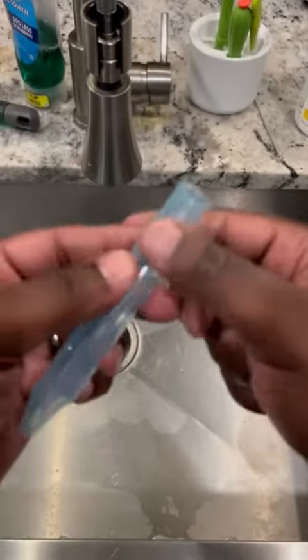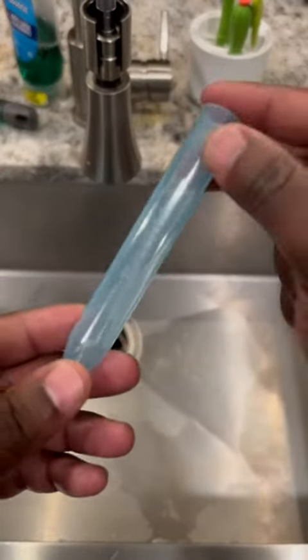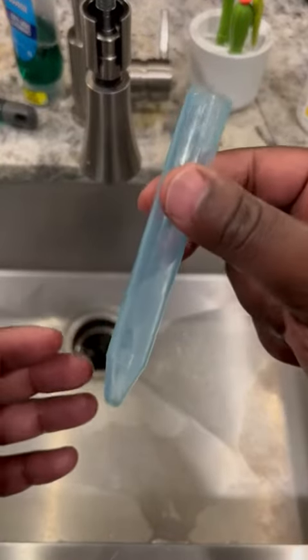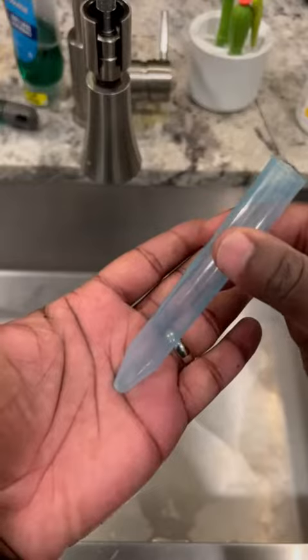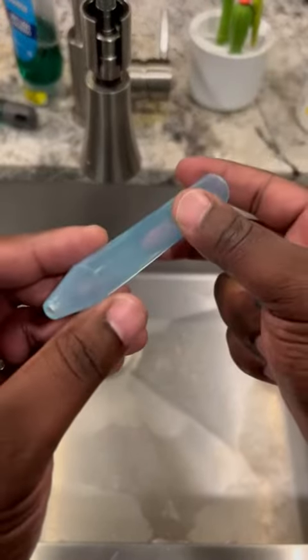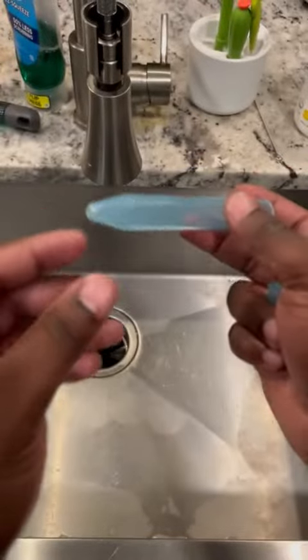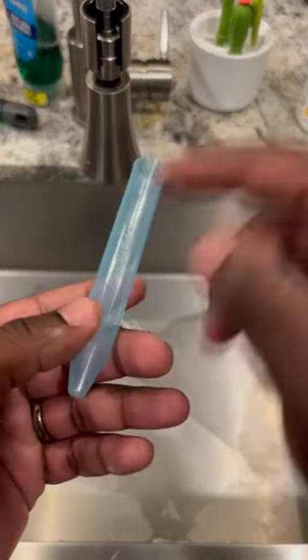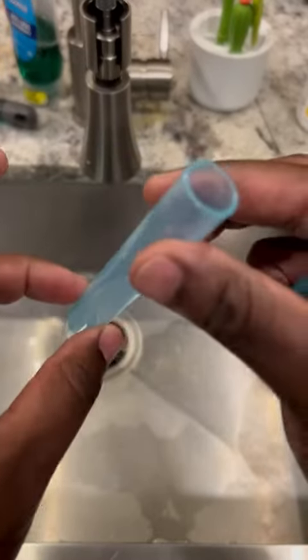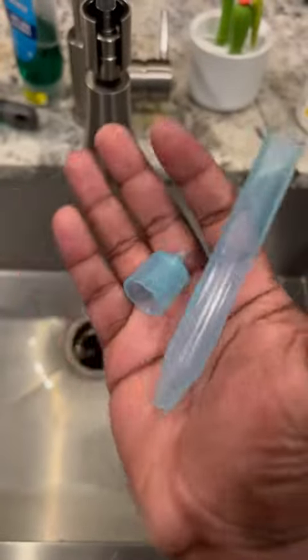One thing you really need to know: when you finish using it, if you leave it sitting down with snot in it, it's going to start running out and it gets pretty nasty. So when you finish, you want to tilt it up or clean it right away. Overall it's really easy to clean, I like it, and it works really well — super simple device.